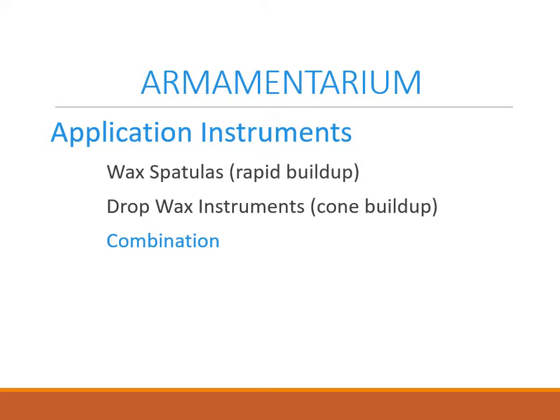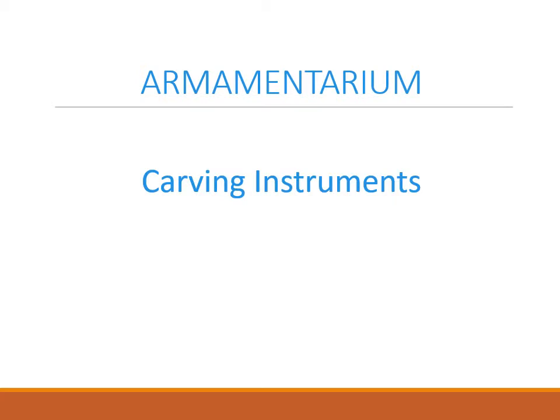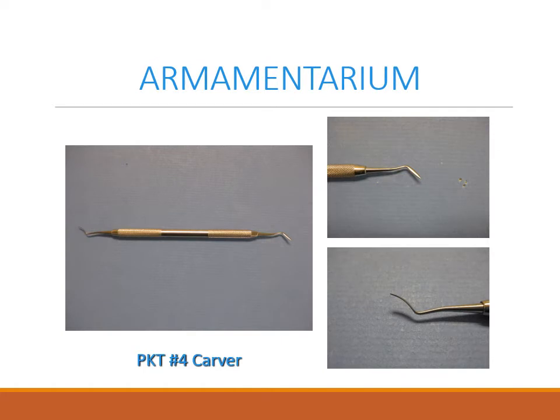Next, we have some combination tools. This tool allows you to both add wax with the spade-like end, as well as carve wax away with the kind of shovel-like end that you see on the bottom left. And then we have just carving instruments. So this is a PKT number 4 carver, and both ends have that flat, almost shovel or knife-like surface. And this will allow you to carve wax away from an edge.